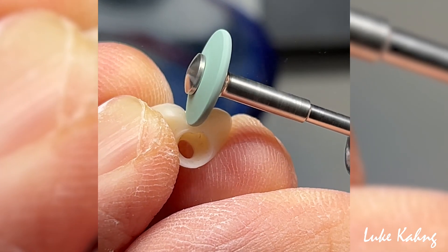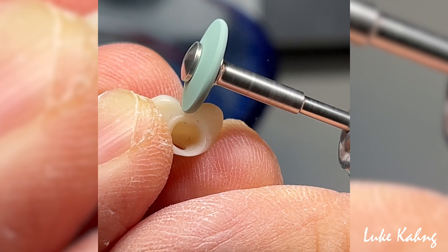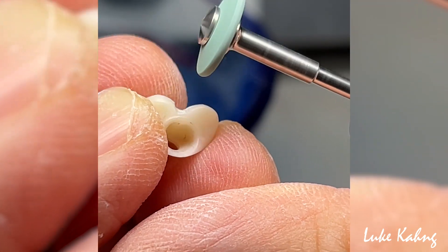First, we start by contouring the zirconia itself. This is after it's been milled, stained, and baked in a dental oven.